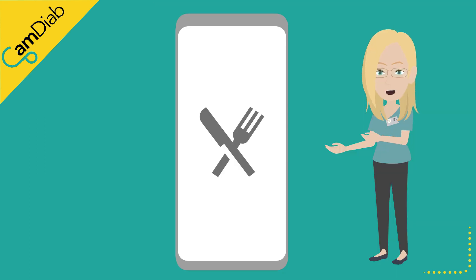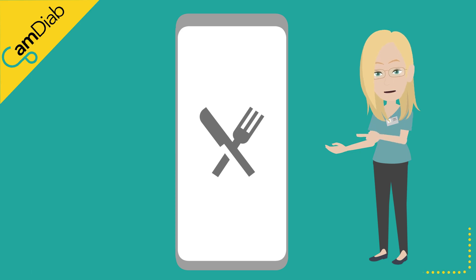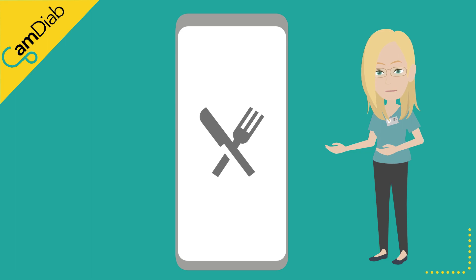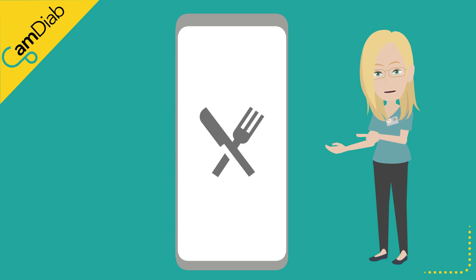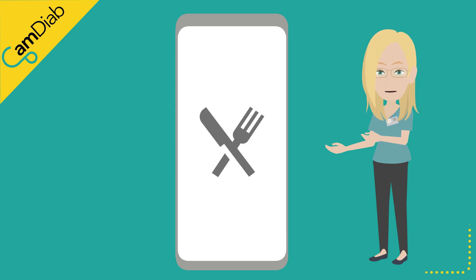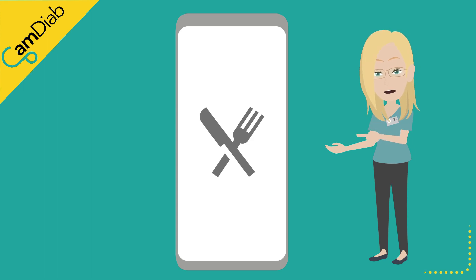On the home screen of the app, you will also find a knife and fork icon. Tap on this symbol to open the bolus calculator. The pump needs to be within 6 meters of the phone when you wish to use the bolus calculator. The phone's screen also needs to have an active security password or lock in place to allow the bolus calculator to be used.